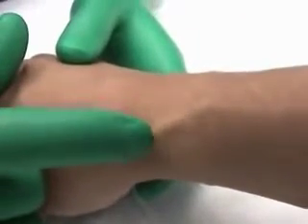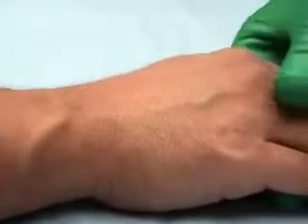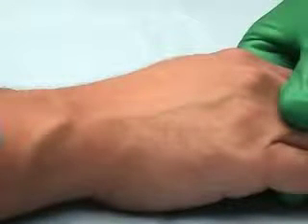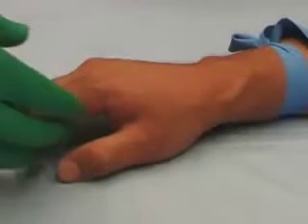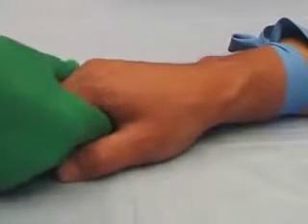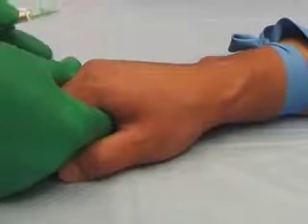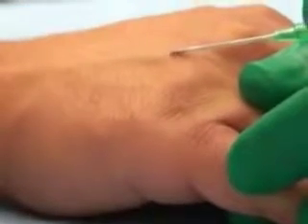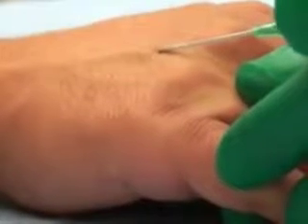Superficial veins are displaced easily and need to be stabilized. Use your non-dominant hand to apply traction to the skin distal to the venipuncture site. If the catheter is placed in the dorsum of the hand, grasp the patient's hand with your non-dominant hand, fingers beneath the palm. Pull downward to flex the wrist, and use your thumb to keep the skin taut.